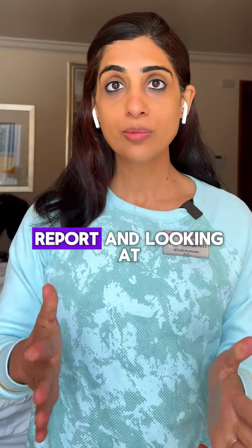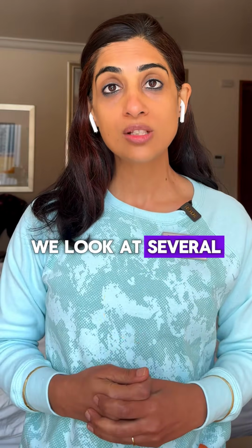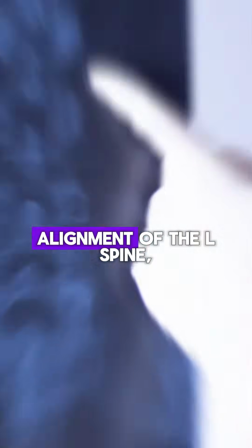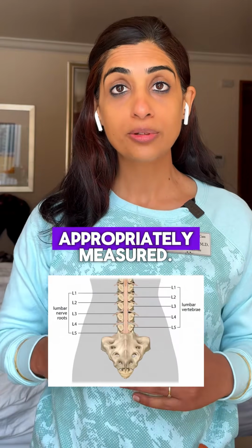Now, it's not just a report and looking at the T-scores and relying on the conclusion for me. As an endocrinologist, we look at several other aspects in a bone density scan. Number one is just the images, like what's been the alignment of the L spine, that's the lumbar spine, as well as if L1 to L4 were appropriately measured.